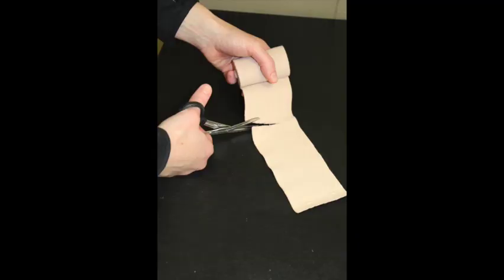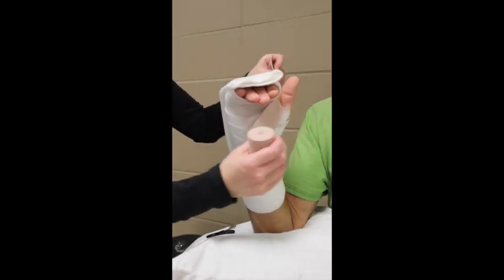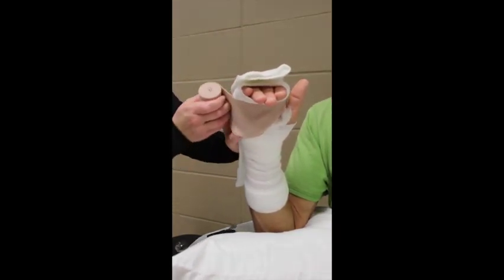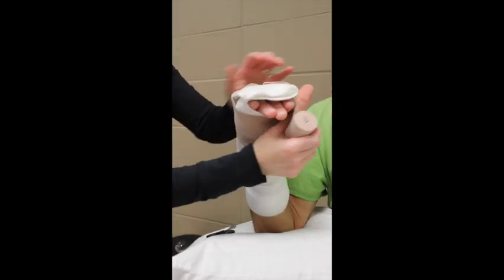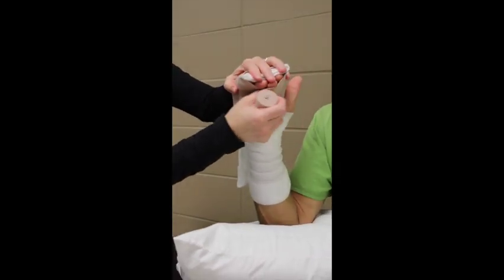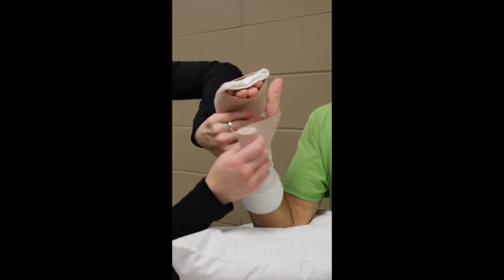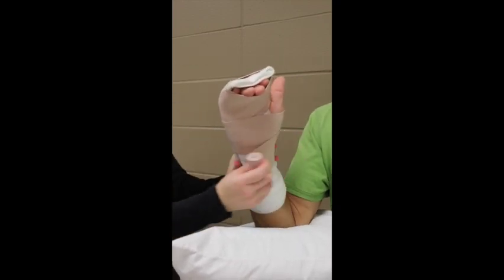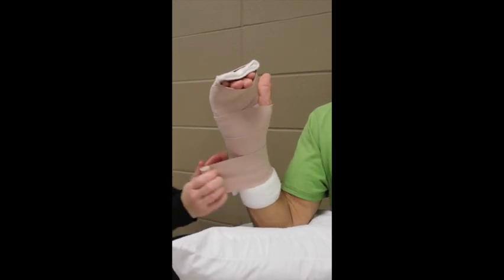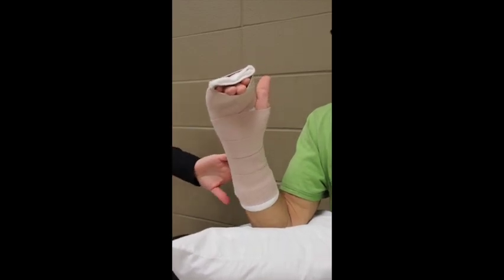Holding the elastic bandage in my left hand, I unroll it a little and about four to five inches in, I make a cut. This will go in the first web space. Take the elastic bandage where you just cut and place that in the first web space. Begin to wrap around all of the fingers in the splint using about 50% tension in the elastic bandage. This is not the prettiest looking splint, but it's going to keep the fingers in slight flexion with that volar or palmar laceration where there may be tendon injury. Continue to wrap proximally, overlapping by about 50%. We should only need one ace wrap for this short arm splint. Use tape to secure.